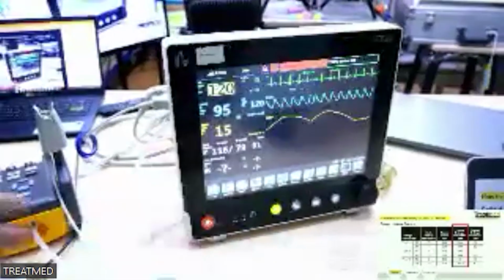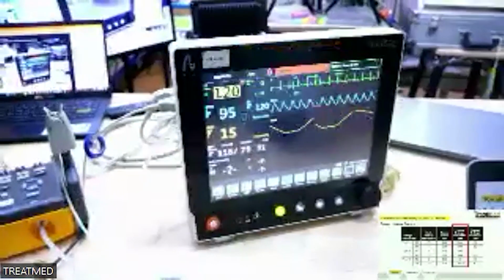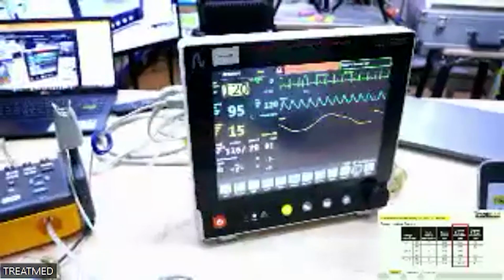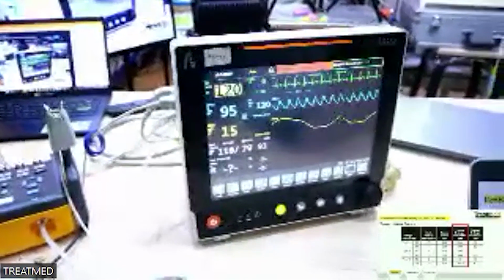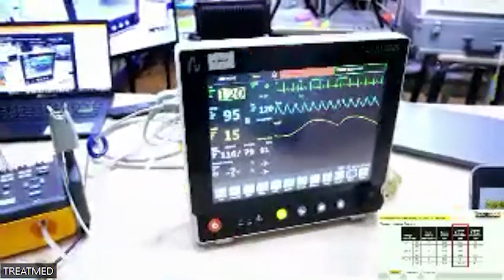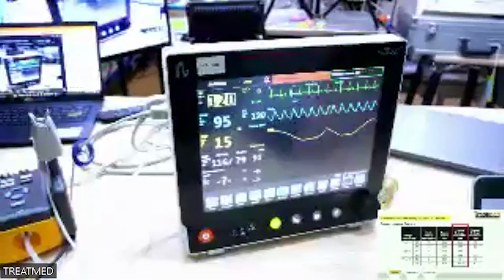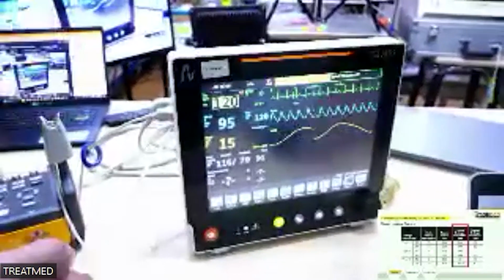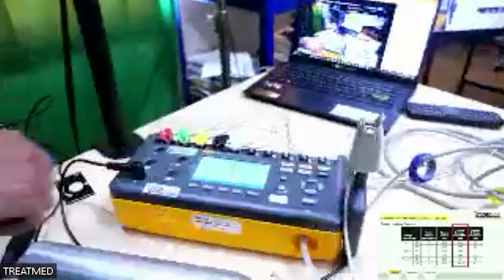For this part, the ECI guideline does not show the tolerance of the dynamic pressure because the dynamic pressure is not standard for testing. For calibration they do not recommend the dynamic test, and for verification we recommend the dynamic testing because in the real situation we use dynamic testing for the patient.